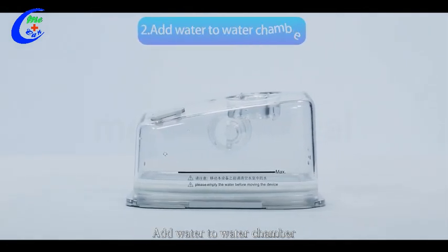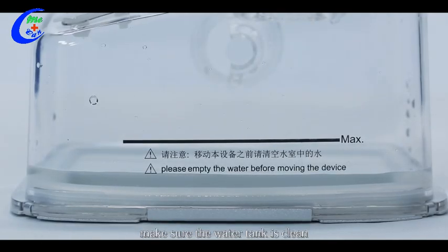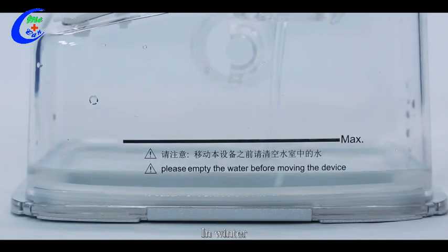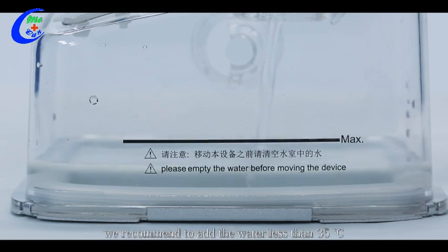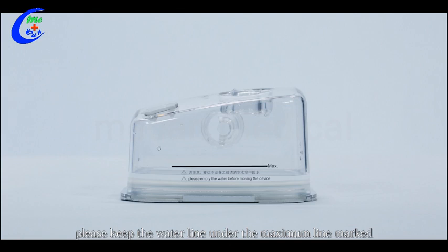Add water to the water chamber. Before adding water, make sure the water tank is clean and there is no water outside the tank. Add still water or purified water. In winter, if you need humid airflow, we recommend adding water less than 35 degrees. Please keep the water line under the maximum line marked on the water chamber.